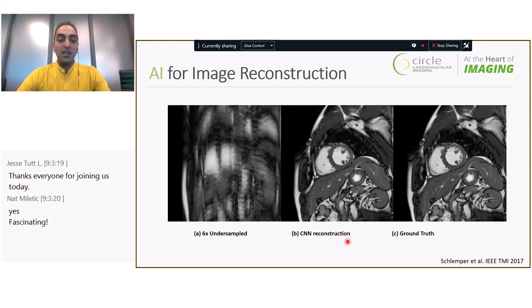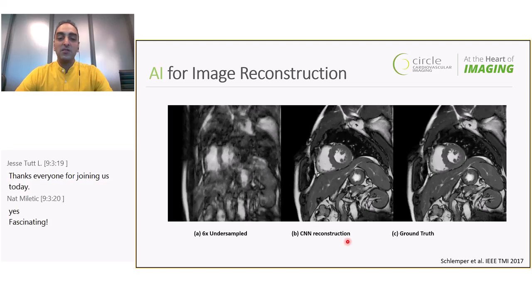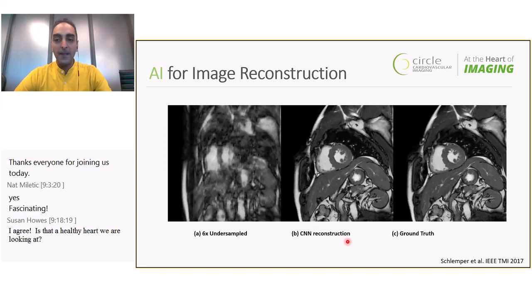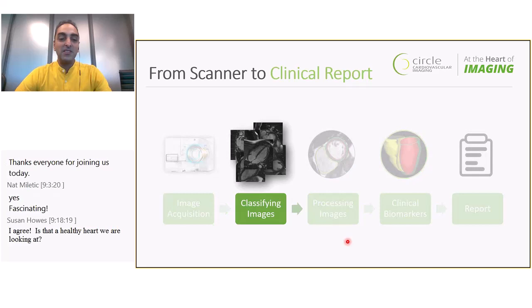And these techniques are gaining in popularity currently, and rightly so, because using methods like this, we can reduce scan times and be able to capture more images to be able to improve the diagnoses that the cardiologist performs on the patient. Now, a downside to reducing acquisition time is that we tend to get a lot of images.